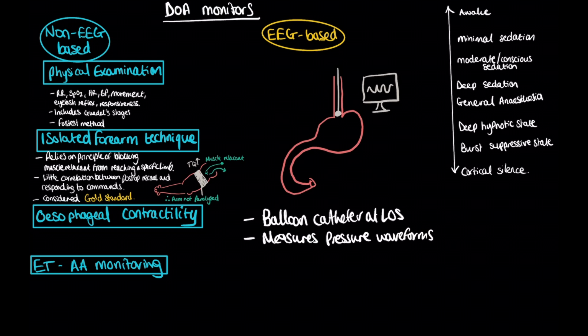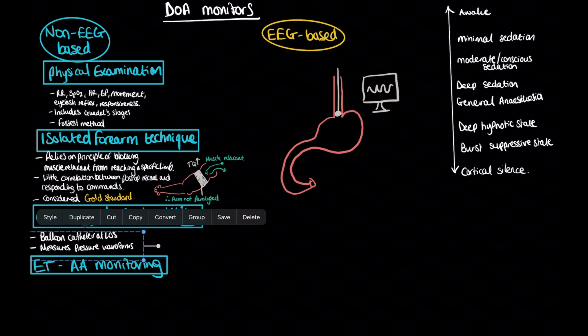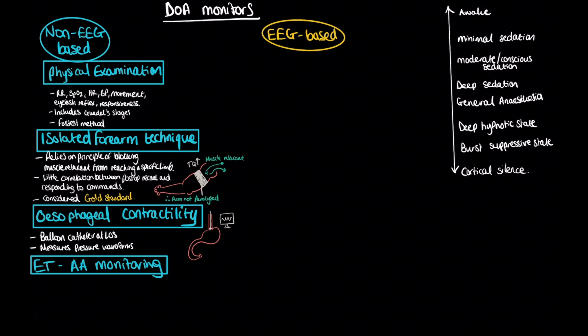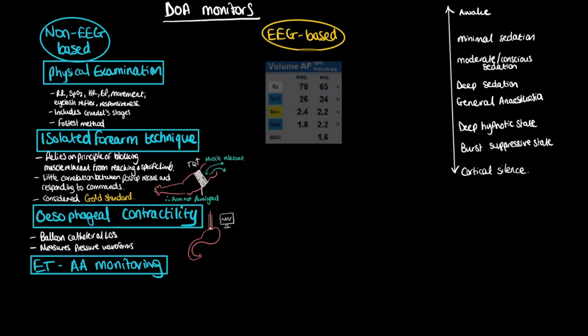If you Google lower esophageal contractility, on the first page I couldn't find a single link to a paper from beyond the 1990s, and that should tell you everything you need to know about its use today. It does appear in some recent exam-focused textbooks, and so I've included it here just for completeness.